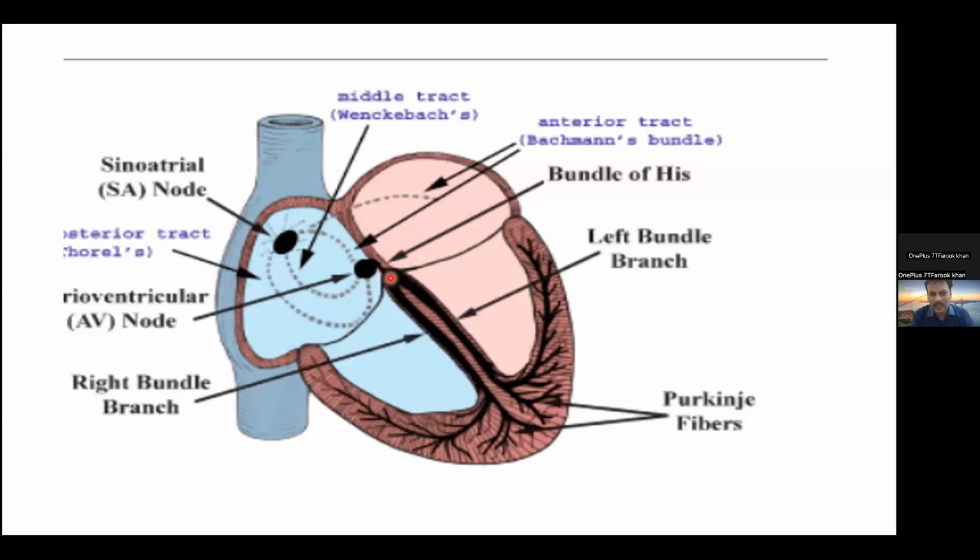After this place, you have the conduction into the ventricle, and the ventricle is contracting. Depolarization is happening. This is the QRS complex. The relaxation, repolarization, will be there in the ST-T waves. You understand how the PQRST is formed.